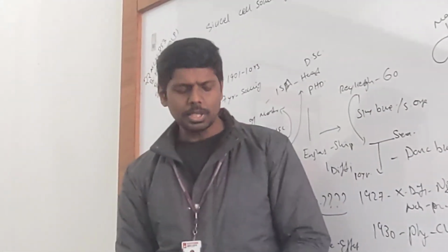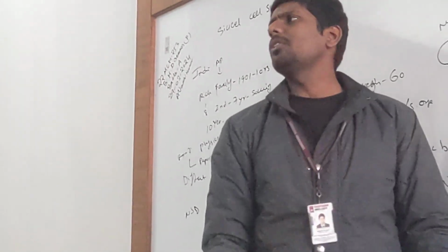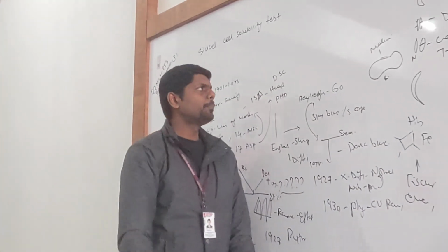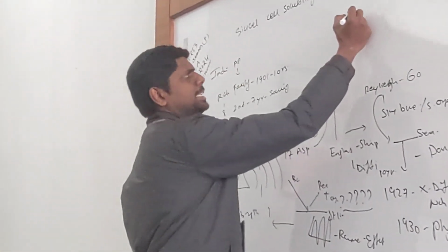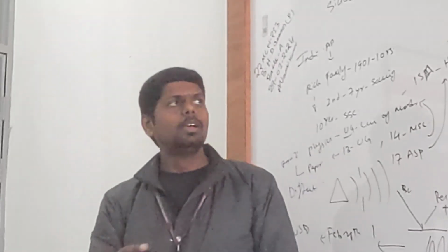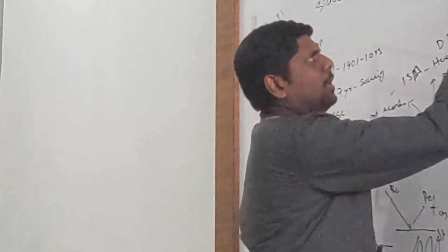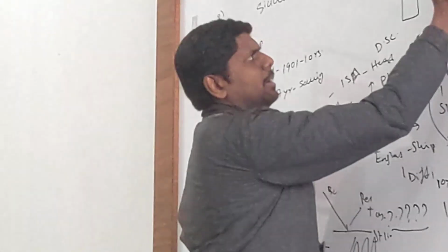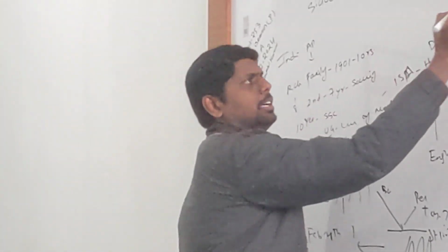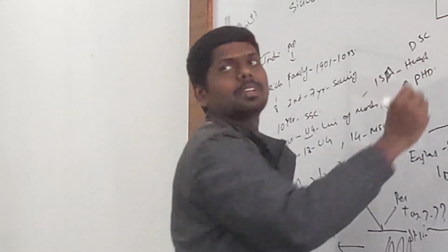Yeah. Then last and final, how to perform this test? How to perform the sickle test? Very simple. I will take the blood sample in a tube. I took the blood sample. Then to this blood sample, I will add saponine. This saponine will destroy the RBCs.